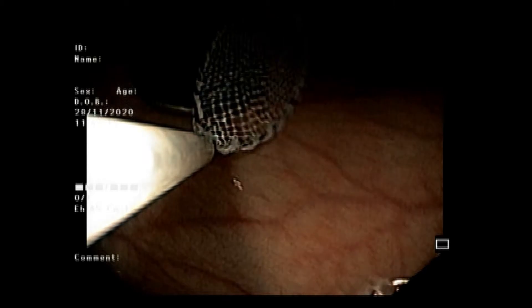We performed an endoscopy under anesthesia and the endoscope shows the coin in the stomach. We then passed a Roth knitted basket through the endoscope and tried to grasp the coin. The coin was successfully grasped by the Roth knitted basket.